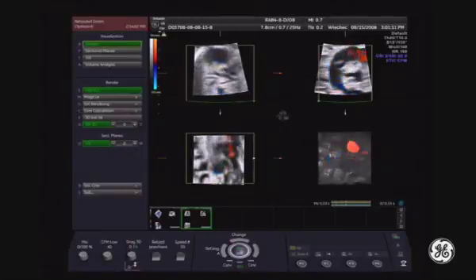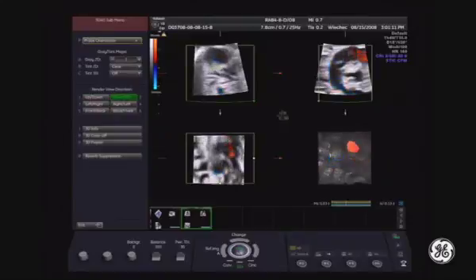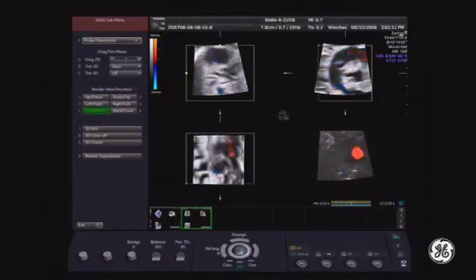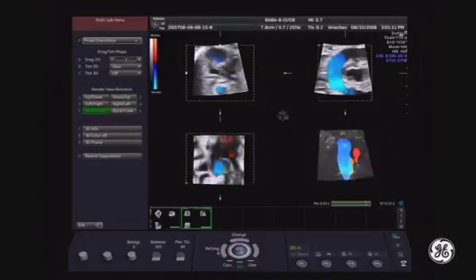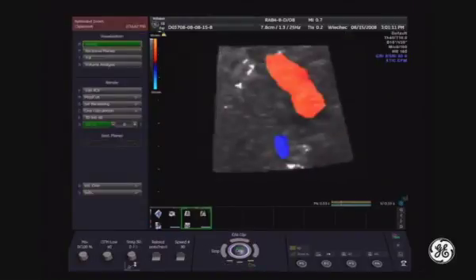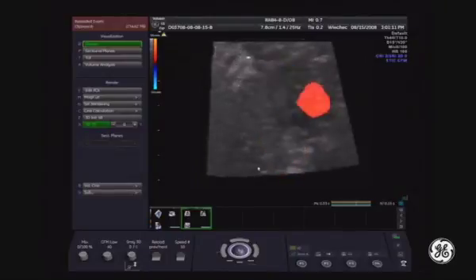So I move to submenu, where I select number 5, which stands for front to back rendering direction. And as a next step, I will move to the reference image B, where I'm going to reduce the size of the rendering box. Now we can bring the rendered image to the full screen, and here you see the only one inflow.